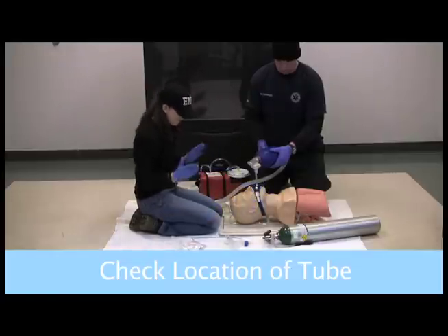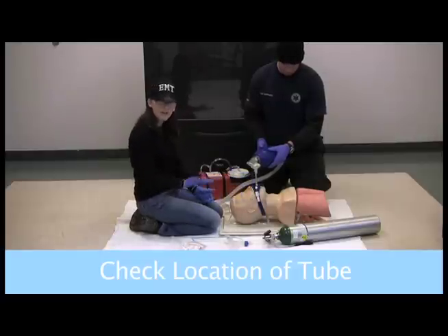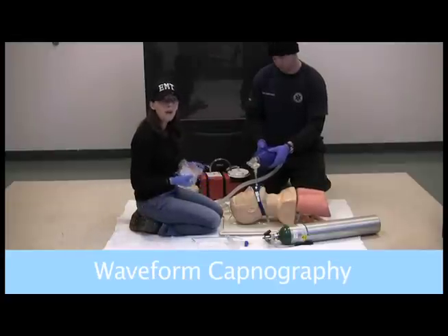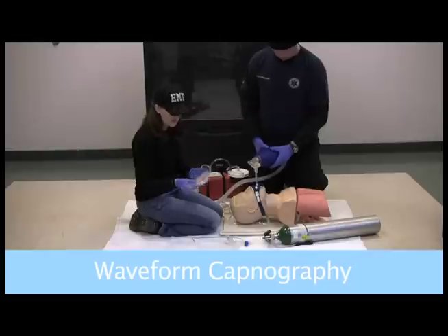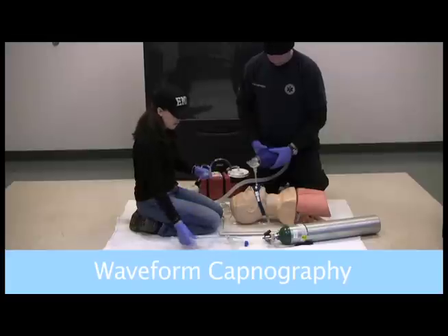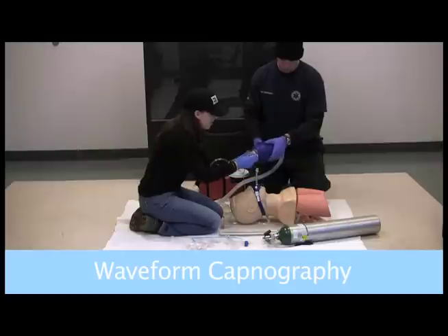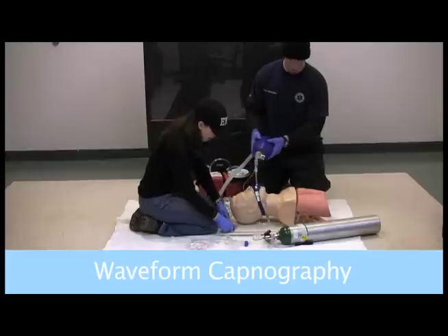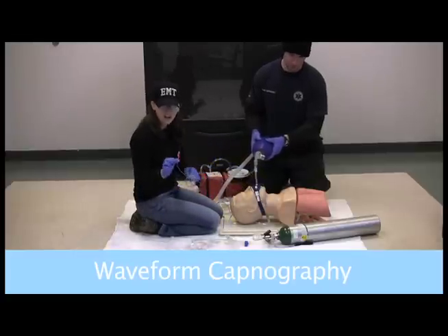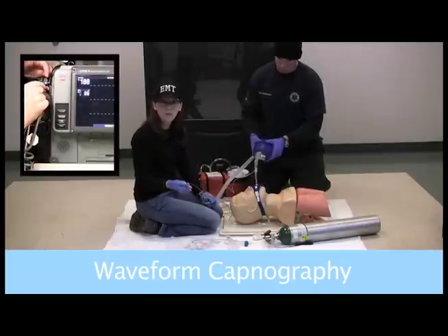Once that is secure, we can go ahead and put on a collar. When we transport him, make sure we transport on a backboard. Once we're in the rig, my region requires waveform capnography. We have a filter line set to allow us to see waveform capnography. I can detach the colorimetric device and continue ventilations as normal. This little orange thing sticks into the monitor and allows me to see waveform capnography.